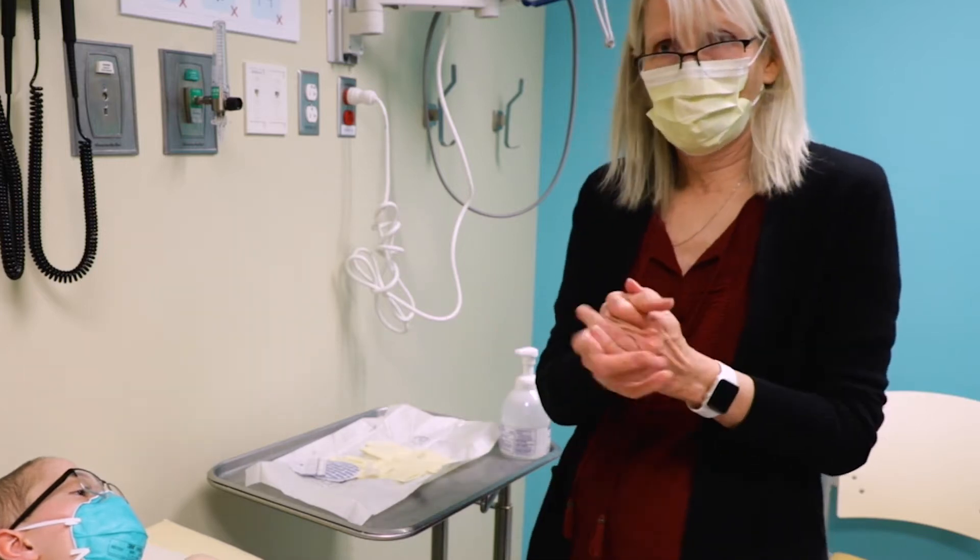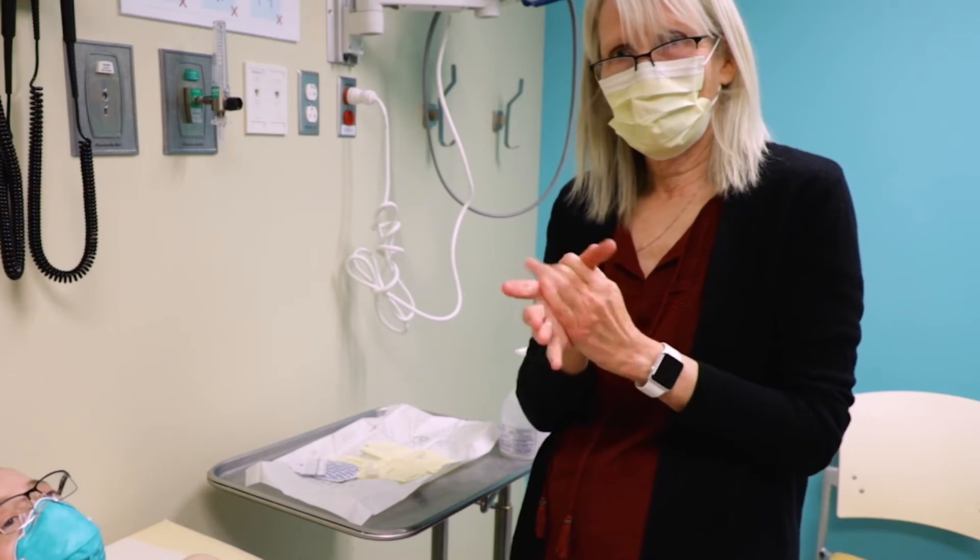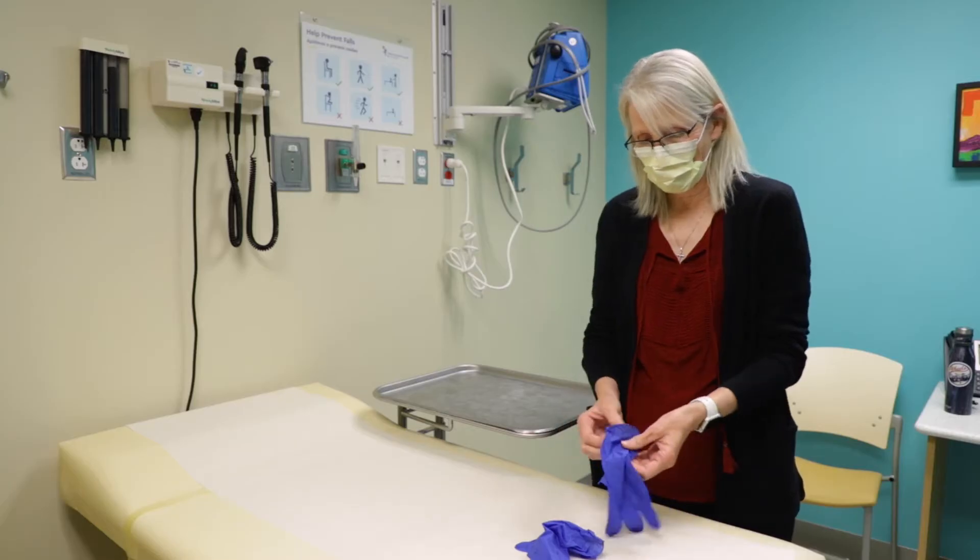Before touching the central line, always wash your hands for 15 seconds or use a hand sanitizer. Next, put on clean gloves.